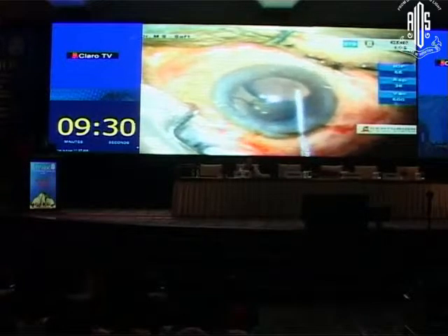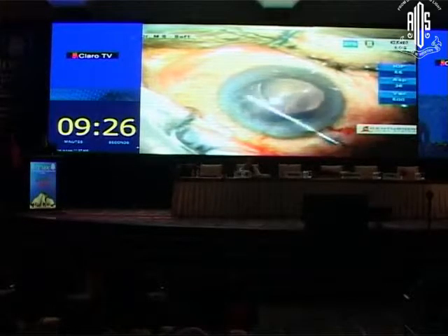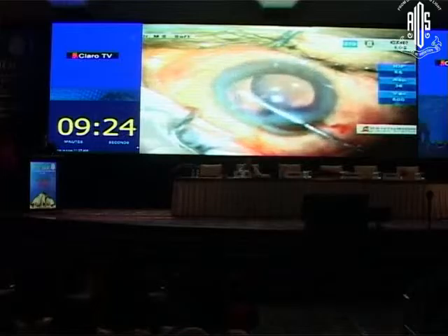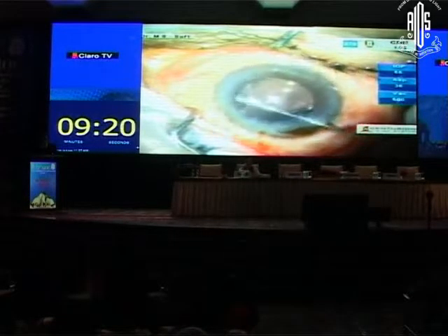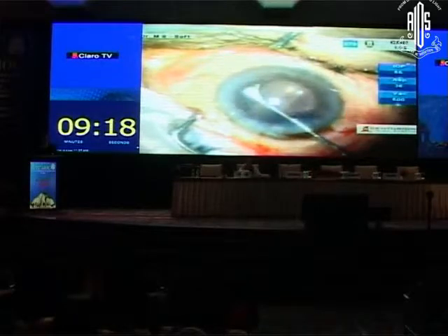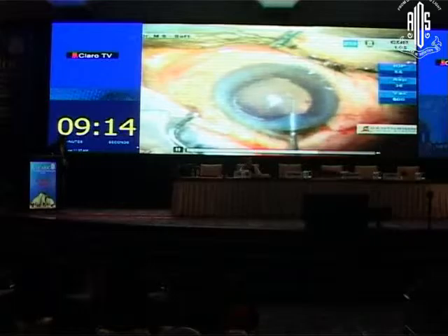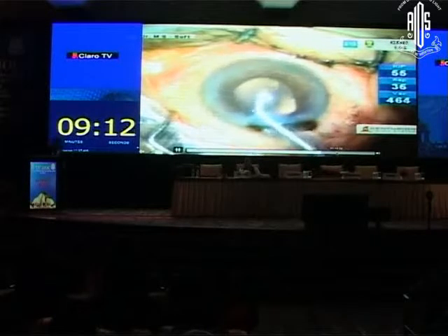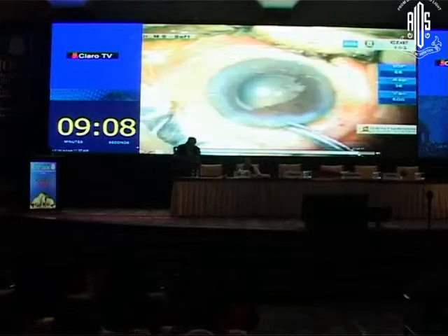And ultimately, I center it, you can see that it's not gone into the bag. And I'm again trying, and it is still not going. And there is a laxity of the capsule that I'm observing. And I just leave it at this, centered. And because of the incision also, I have to put a suture. So these are the problems that I had.